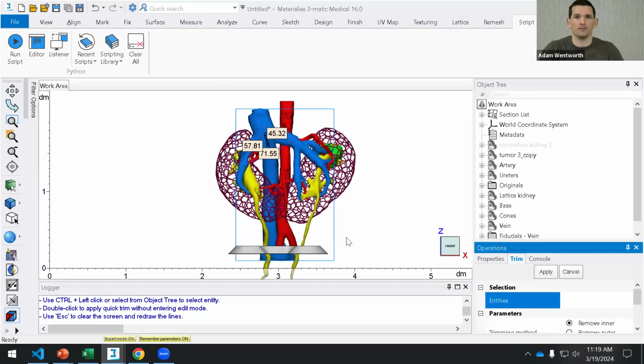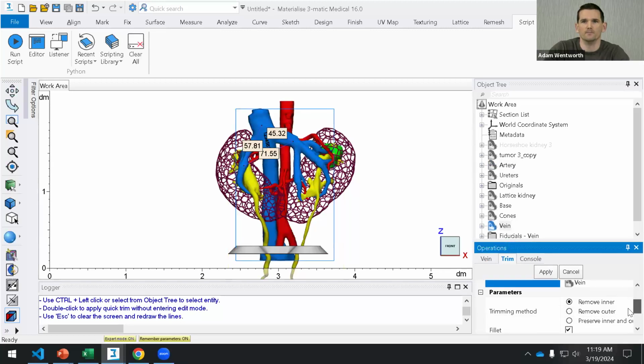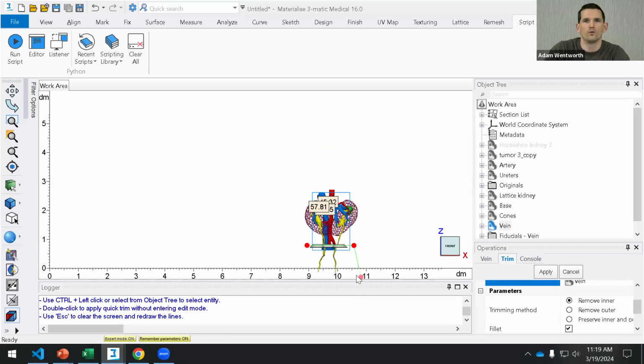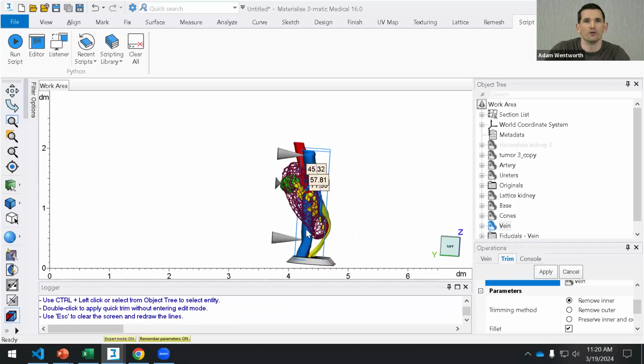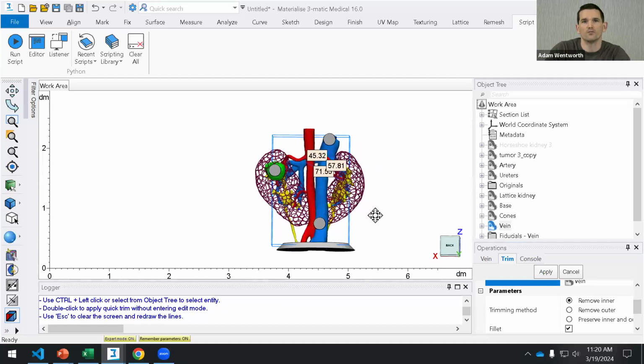We could then do some simple quality control where we didn't trim things before, but we can do that really quickly. We might also double check the center of gravity of that base. Make sure that the model's not going to tip over when it's printed, so I might change that slightly. But overall, that's about 40 to 45 minutes of design time done in about 5 minutes.